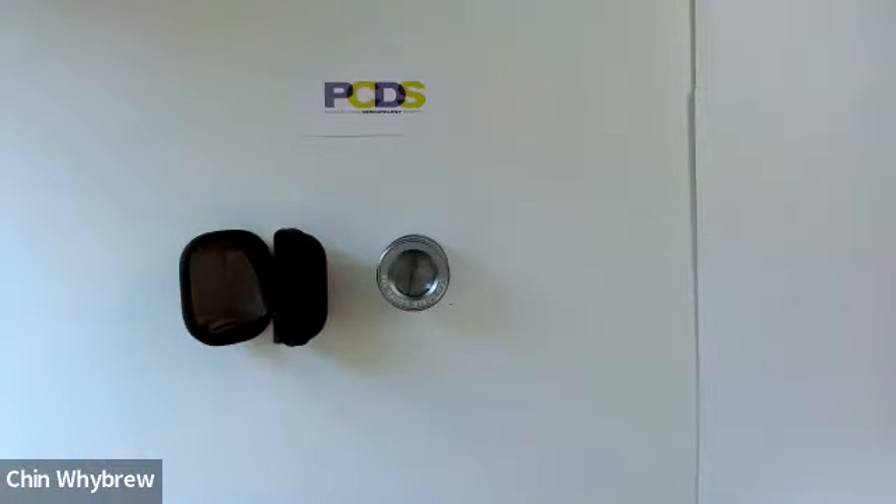So that is a jeweller's loupe that can be used as a fixed focus non-polarised dermatoscope, and you will get fairly decent quality pictures through it as well. To learn how to use it in more detail and how to interpret what you see, please do come along to one of our Dermoscopy for Absolute Beginners courses, accessible through the PCDS website at pcds.org.uk.